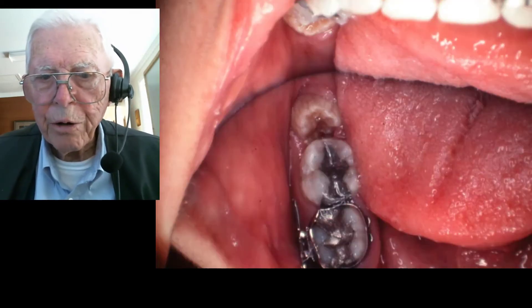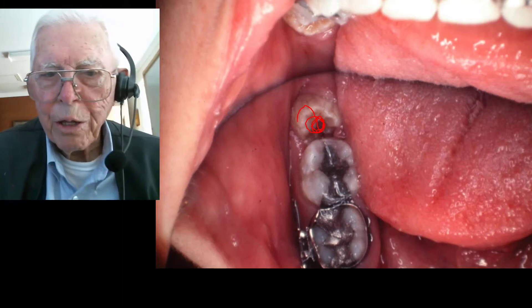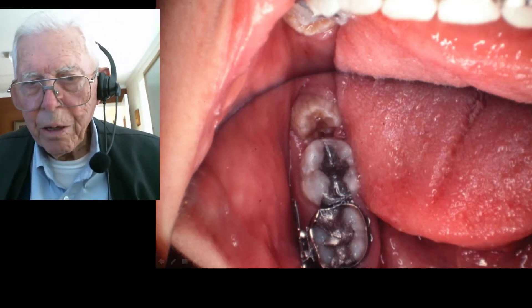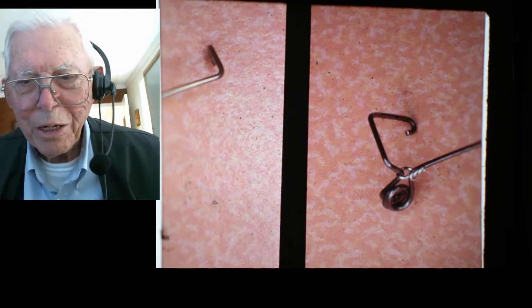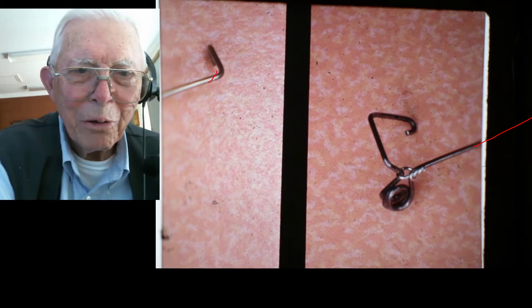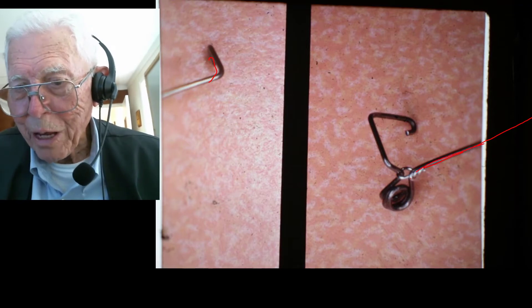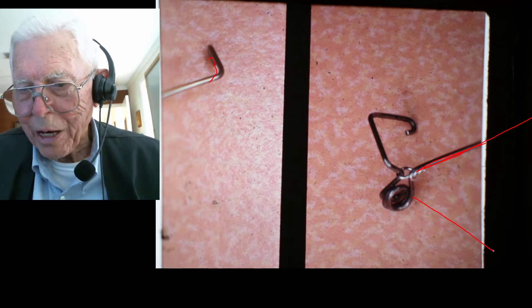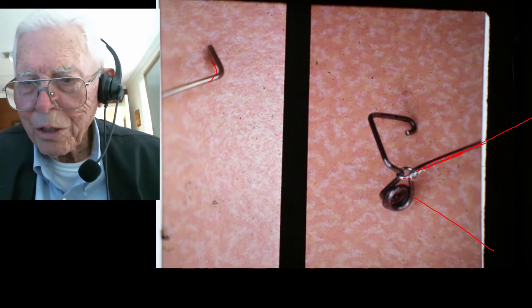Now here you can look down on the tooth — here's where we put the bonding material, the acrylic, and then we embedded that wire spring into that. I sent this off to be photographed — that was back when I sent our pictures off. This is going out here, but I just stuck it in. There's the little hook we had on it. Now if you look at this, this leg of wire right here was going down about like that, and I pulled it up and tied it so I could bond this thing on.